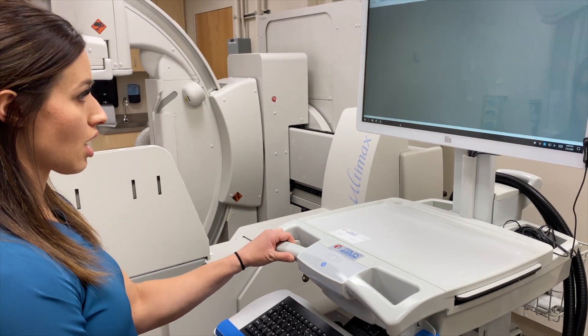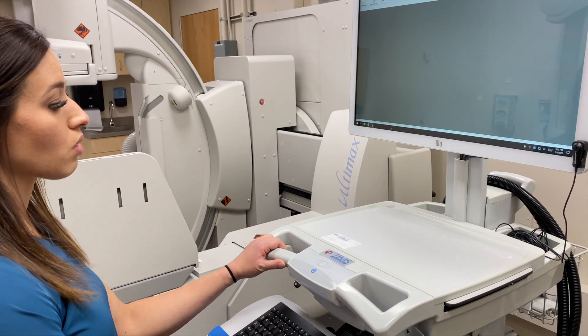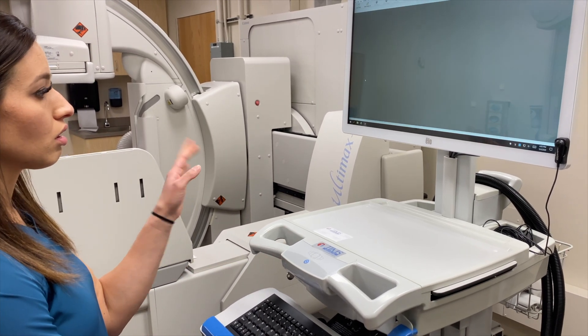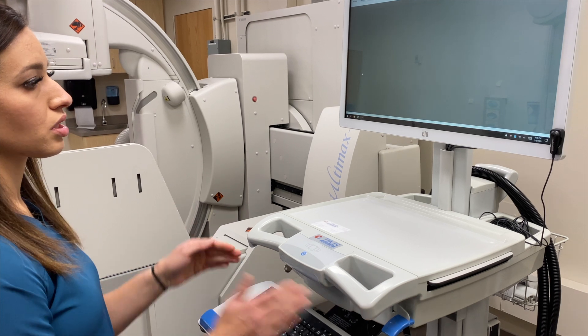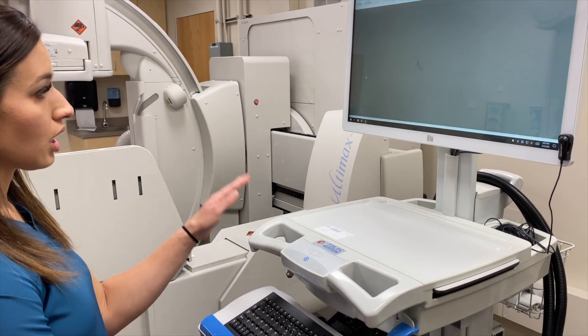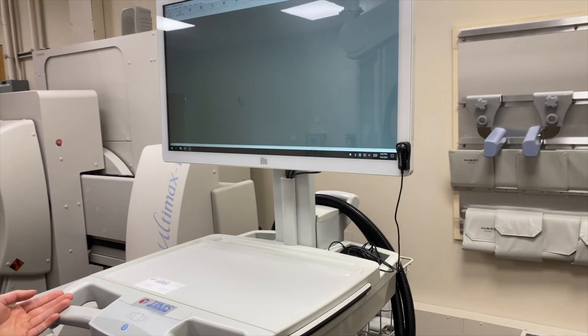This is our TIMS tower. This is specific to swallowing studies, especially with speech pathology. They can record all the fluoro swallowing studies with the different thicknesses that they use, save it all, and then go through that film immediately with the patient.